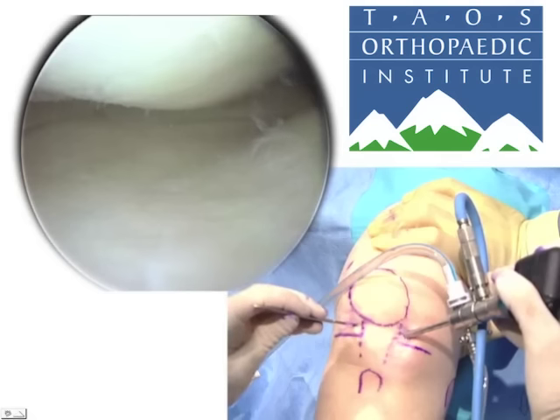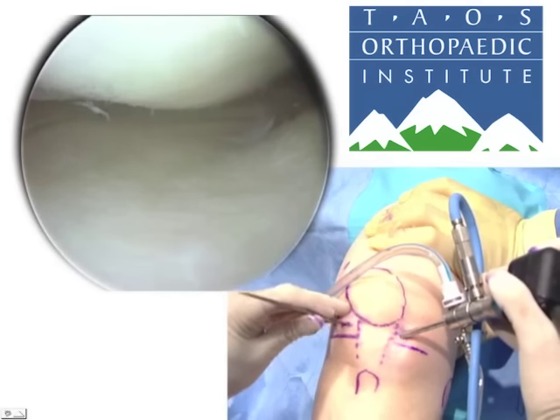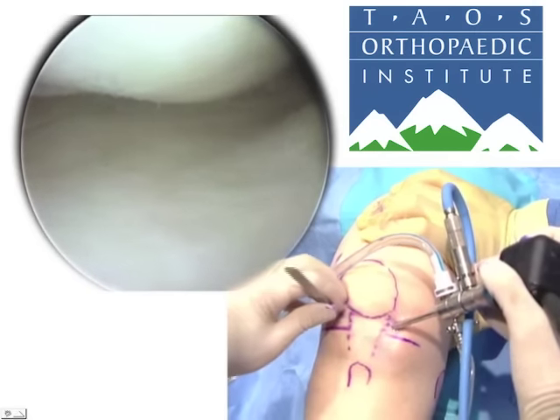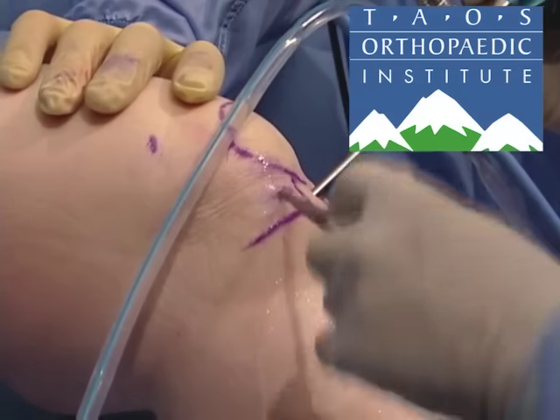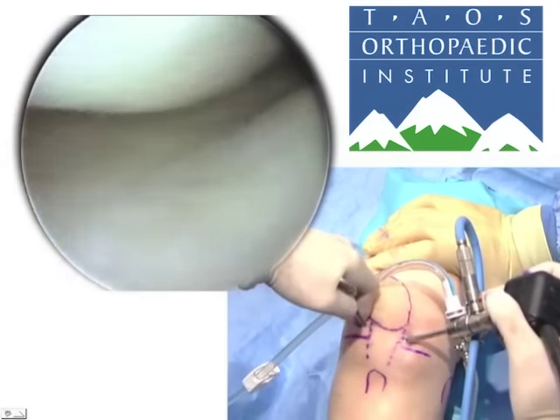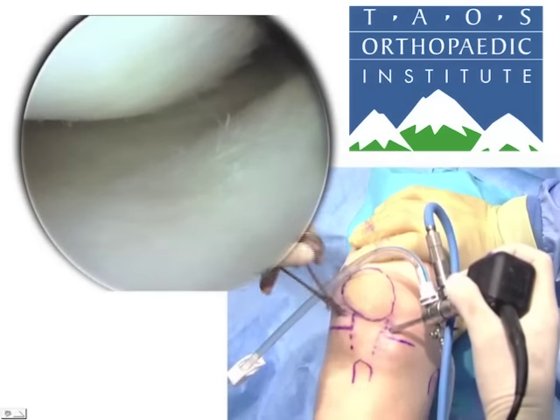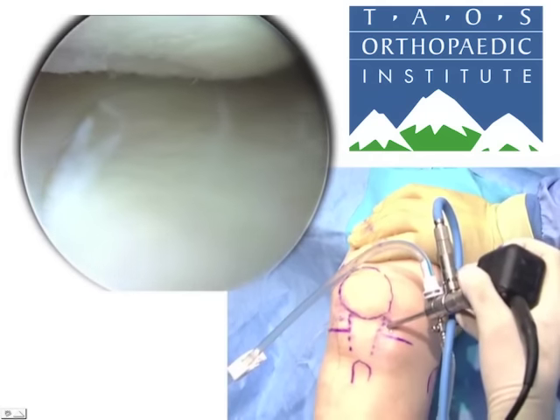This seems like a perfect portal location, so we'll pull the needle out, take our knife, and first cut the skin approximately five millimeters, then deeper — holding my hand against the skin for control — cut the capsule. You know you're there because the fluid starts coming out. This is our working or instrumentation portal. I like to take a hemostat, hold it so I don't plunge, put it into the portal and spread a few times — watch your eyes, this can squirt — to have a nice loose portal so you can come in and out with ease as you do work in different areas of the knee.